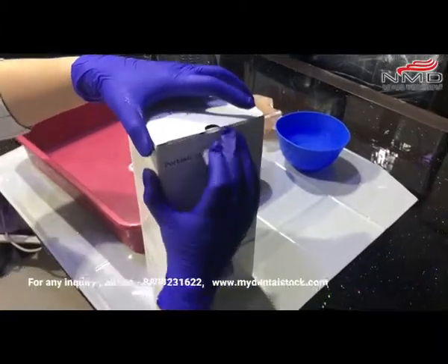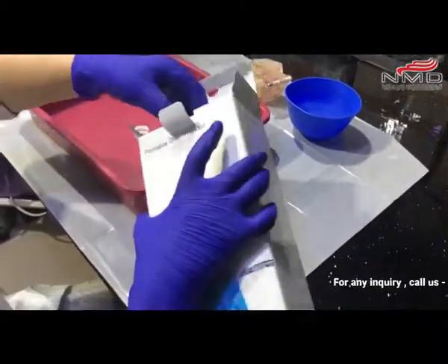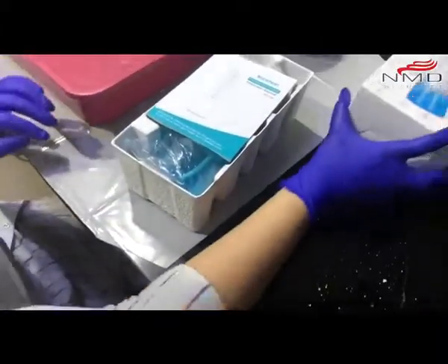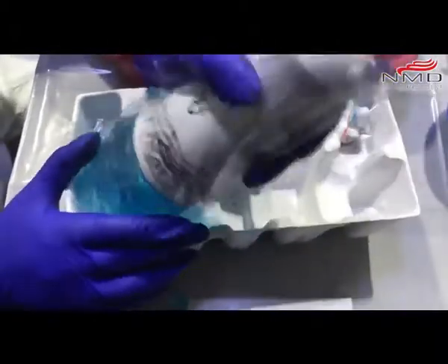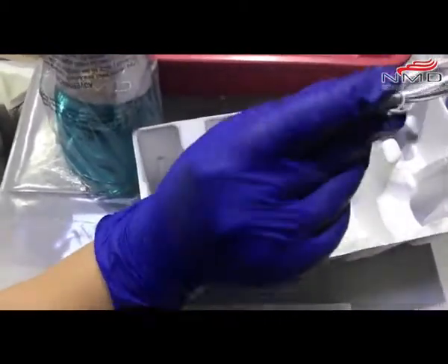Let me unbox this first. So we are having one manual. This is the bottle. We have two nozzles and one chargeable battery.